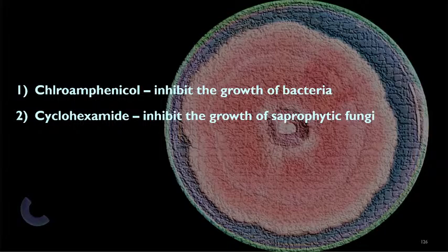majority of the time, the samples that are going to be submitted for mycology studies are going to come from the skin or maybe the environment, if you are working in a laboratory that does environmental microbiology. So in hospitals that have strict infection control protocols, they will have swabs of the floors, swabs of doorknobs. And part of the protocols for these types of hospitals is they want to have a sterile room or a sterile area. So saprophytic fungi also need to be taken into consideration, because they might cause misdiagnoses or uneventful things to happen to your samples, or specifically to your fungal cultures.